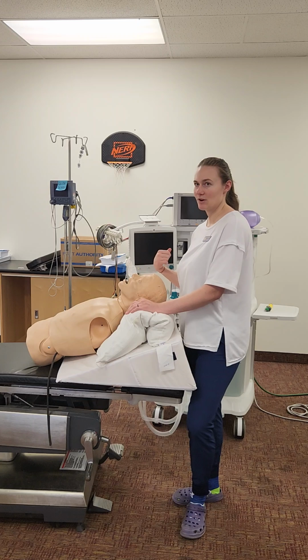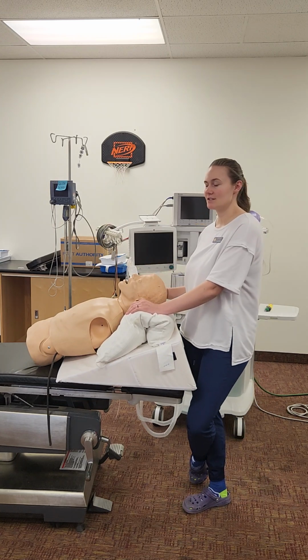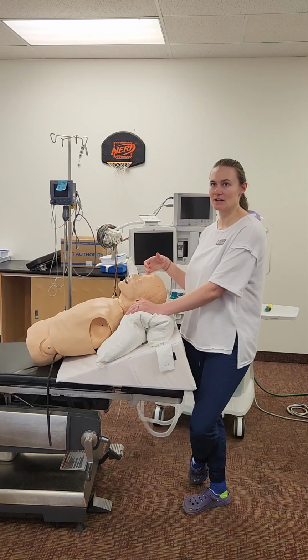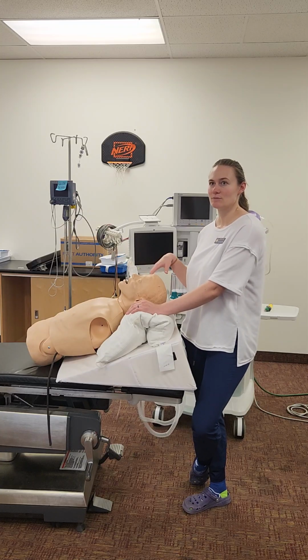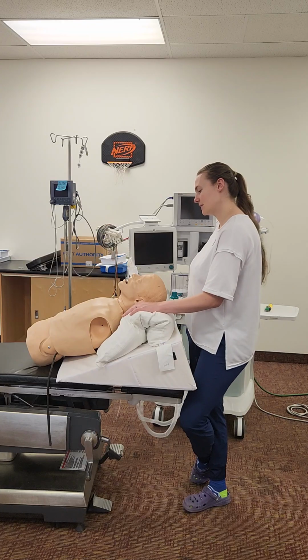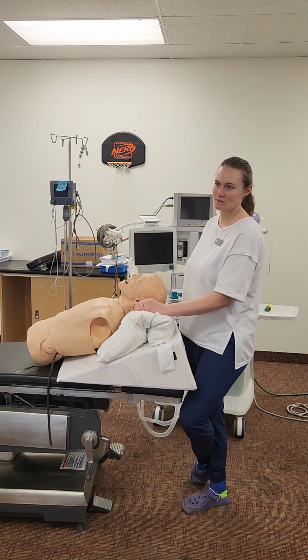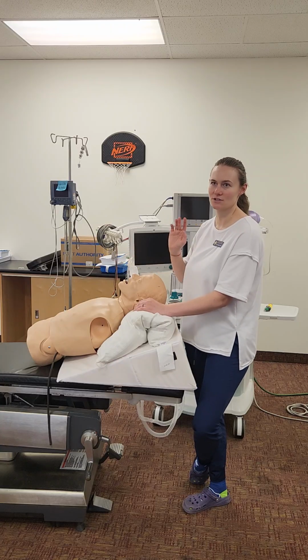And now I can use my rocuronium once his airway is secured, wait for paralysis, and then I can turn on my sevo at 2 to 3%, and then reduce my oxygen to 2 liters per minute because we are using the sevo. And then now I'm assessing for further loss of consciousness or if he's starting to wake up, and just make sure he's still in stage 3 and the surgery can start.